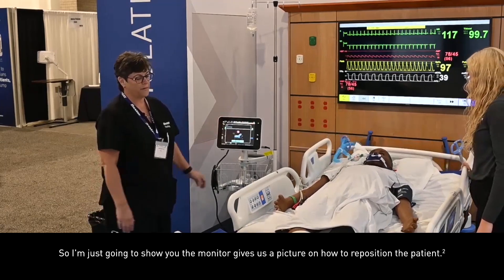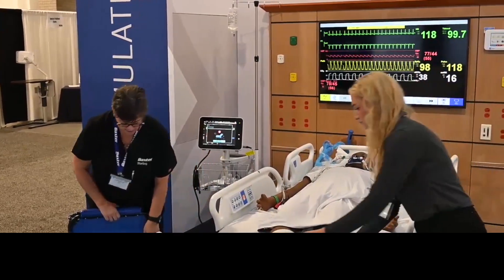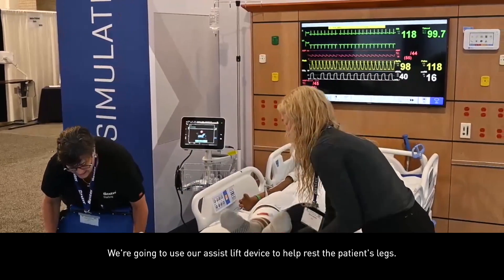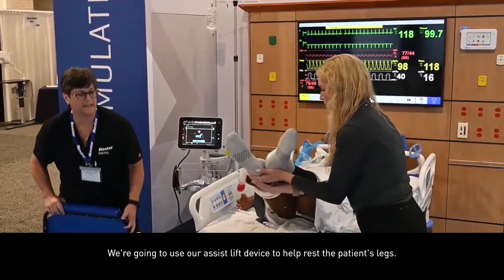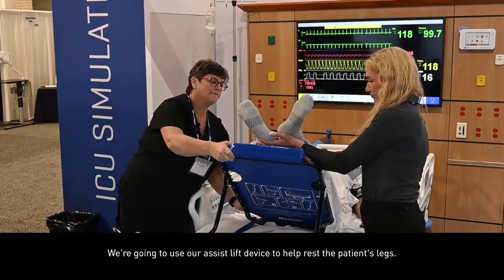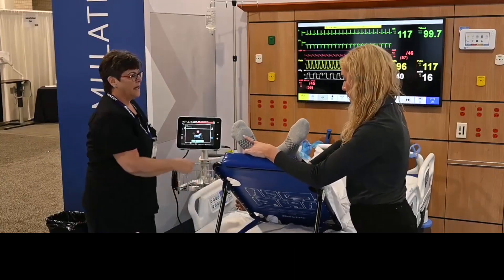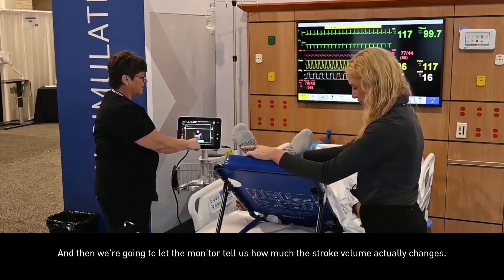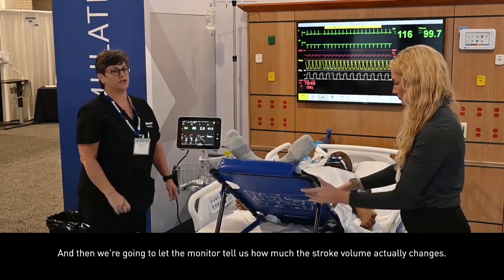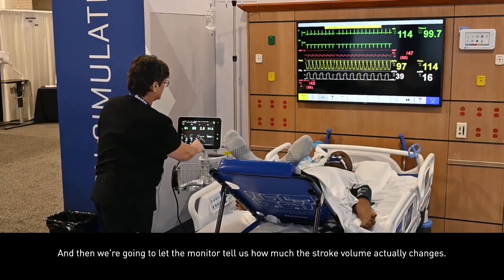We're going to place the head of the bed down. We're going to use our assist lift device to help rest the patient's legs. Then we're going to let the monitor tell us how much the stroke volume actually changes.